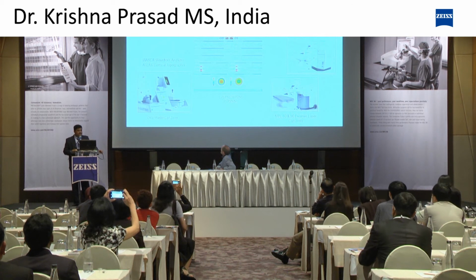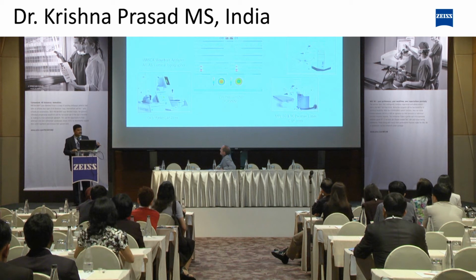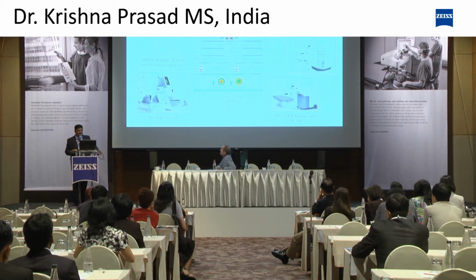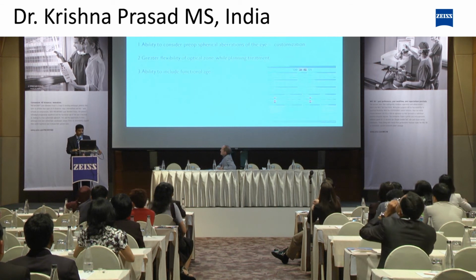At 37 years we reduce from 1.5 to either 1.25 or plus 1 diopter. If the patient is around 48 to 50 years, we increase up to plus 1.75. Why can't we increase to 2? Because then the patient may lose binocularity.